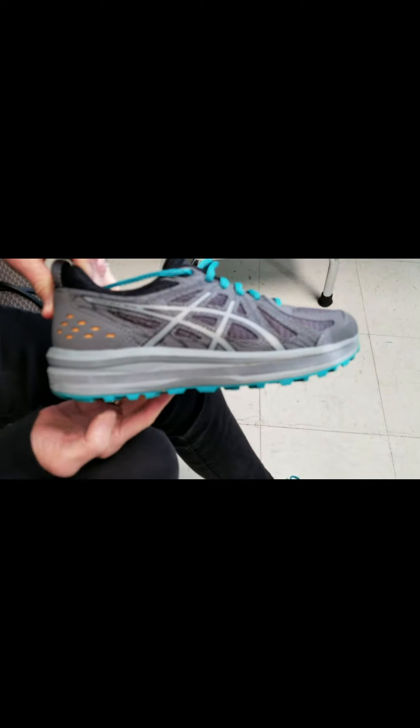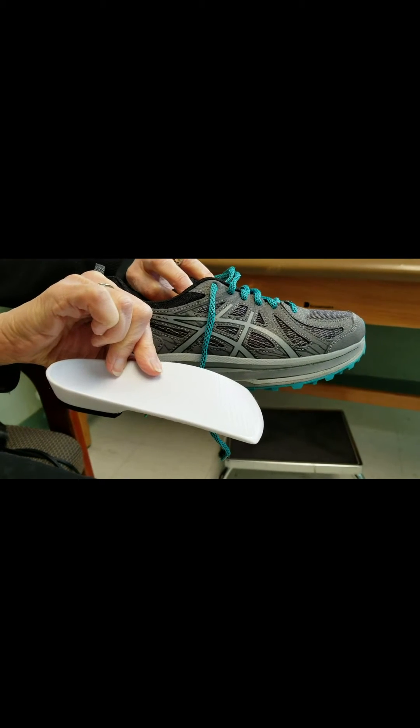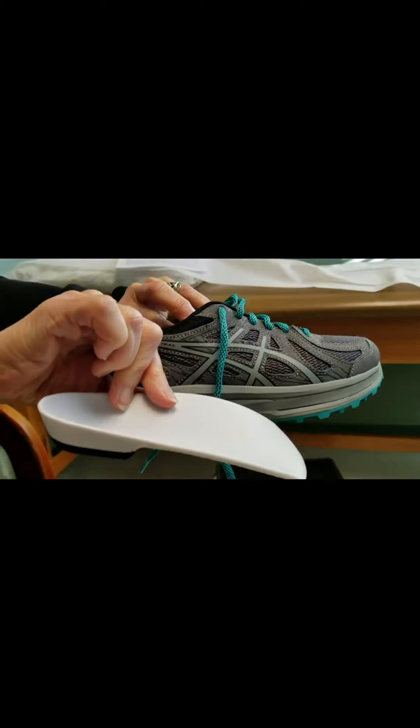Here's the shoe that was not lifted, and then here's a shoe that had a full quarter-inch lift added into it. And here's the orthotic with the quarter-inch heel lift added to it.